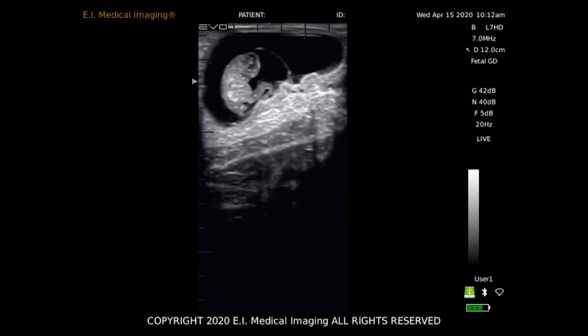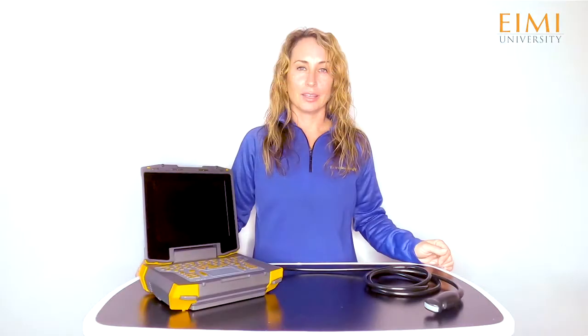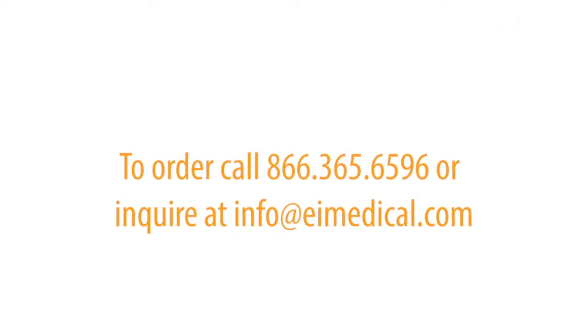The Evo offers all of this at a competitive price and with excellent resolution. There's almost nowhere that the Evo doesn't belong. Contact your rep today to discuss the best packages and options for you and to find out about current pricing and discounts.